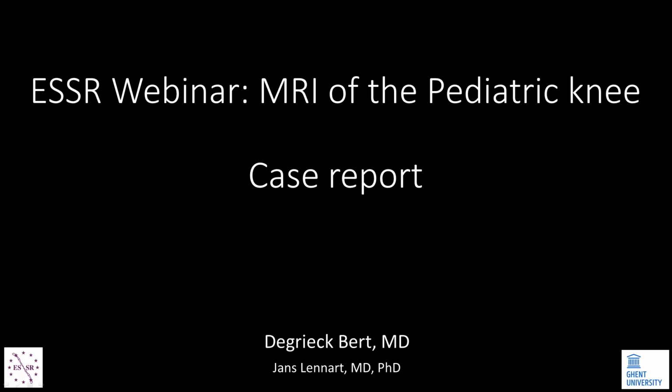As is usual, we are going to start with a case presentation, which is going to be done by Dr. Bert Degrieck, also coming from the University Hospital in Ghent, Belgium.